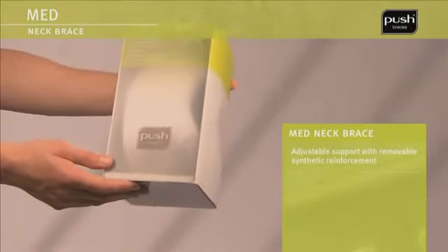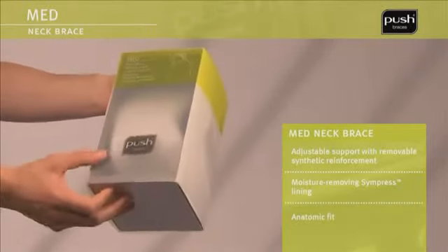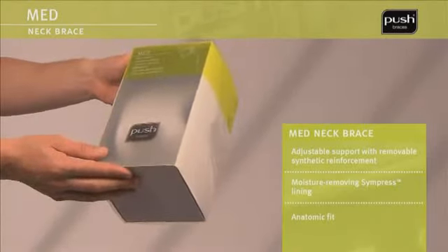The PushMed neck brace provides support for the vertebral column through its anatomical shape and the use of semi-rigid foam. The neck brace also includes a detachable element for additional support.